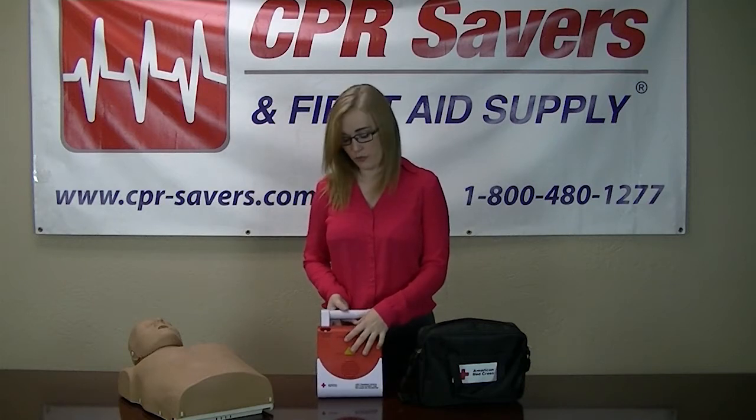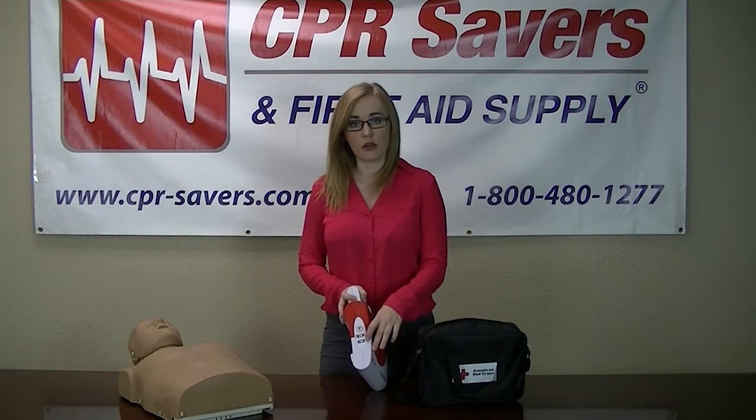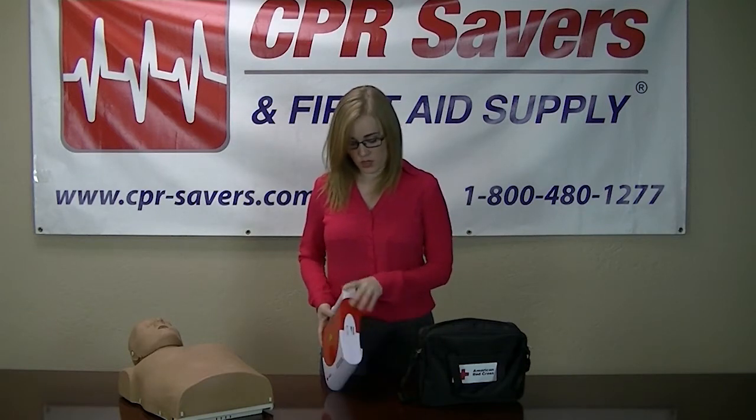On the front you have an on-off button and a shock button. On the right-hand side, you're going to have two scenarios — one is up, two is down. You're going to have an English and Spanish setting as well, along with the pause and play button in case you need to pause the scenario. On the left-hand side, you're going to have a volume control.